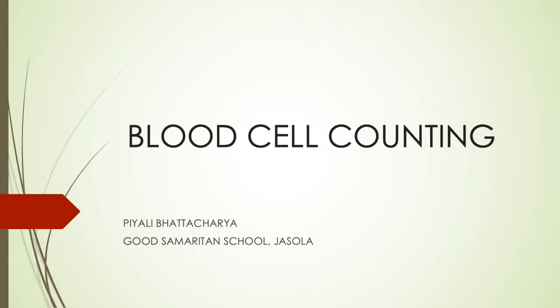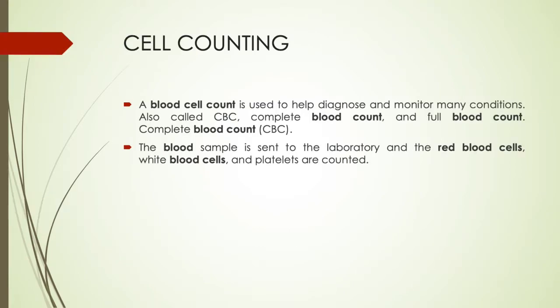Already we have learnt about the blood smear preparation and the staining of the blood smear. Now today we have to learn about the blood cell counting. That means how can you count the blood cell in the patient's blood. Cell counting is a very important part to diagnose any kind of clinical condition of our body. It can be a complete blood count, also named as the CBC.